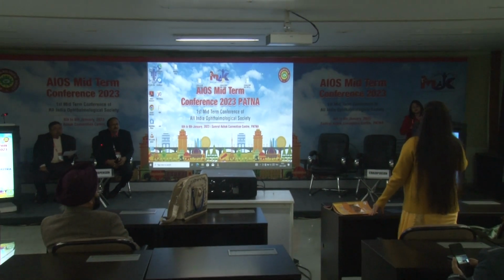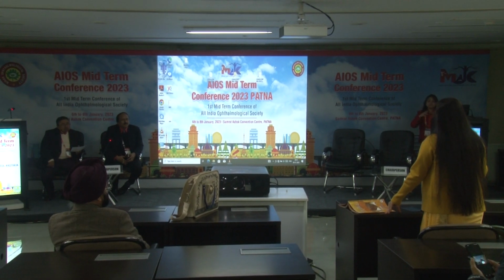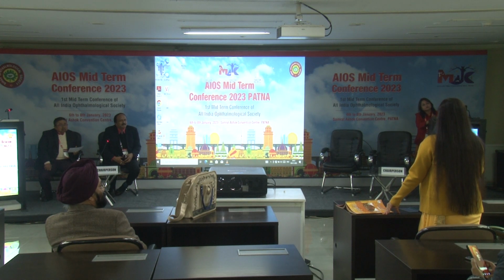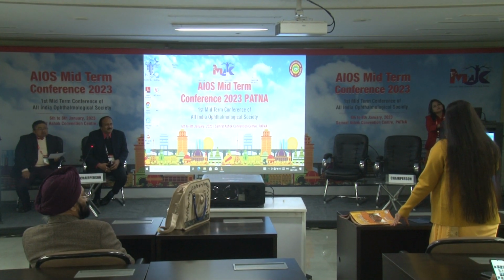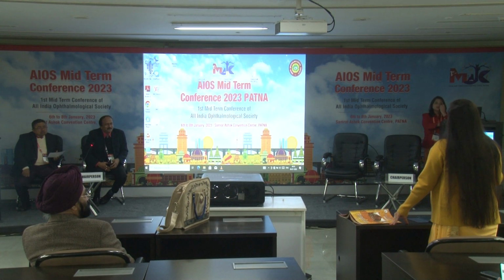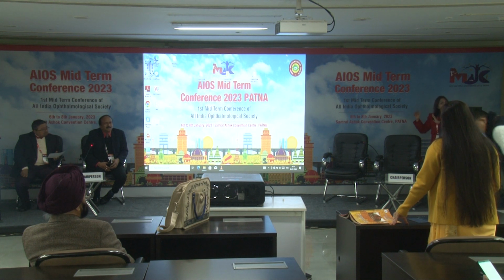Yes, I had to wait, ma'am, because these are very long eyes. This lens, -17, I had never used, so the ELP I was very worried about. Another way of looking at it is, if we have done the refraction at 1 week, and if it is stable, then why not do an IOL exchange? The refractive error did not change in 1 day, 2 days, 3 days. It changed over 1 week, 2 weeks, 3 weeks.